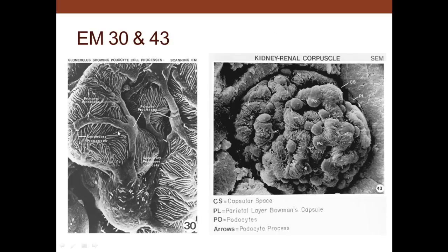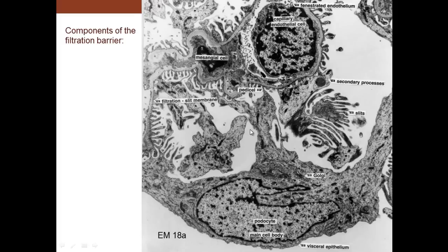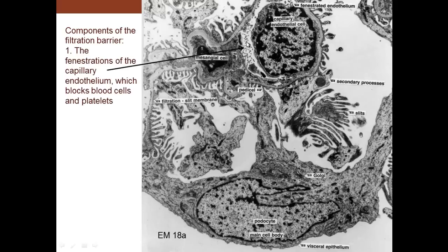Here we see the podocytes. There's major and minor processes as they entirely cover the capillaries. The capillaries themselves are fenestrated. We see more podocytes, and these are sitting in Bowman's space. So the different components of the barrier. Here's a podocyte. This would be Bowman's space. This is a capillary, so this would be the endothelial cell, and you can see it's fenestrated in through there. So you have fenestrations, as you can see them there. You can also see them right in through here as well.